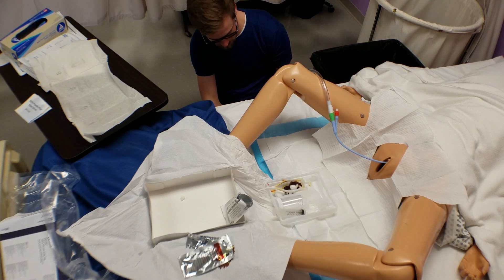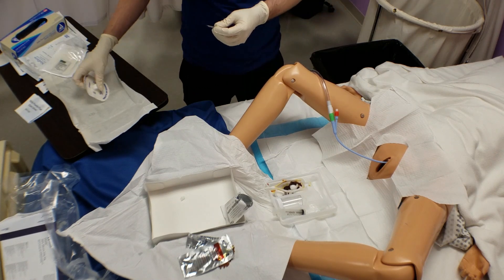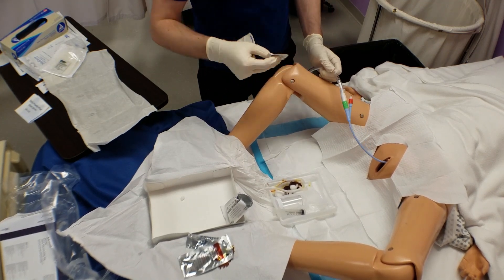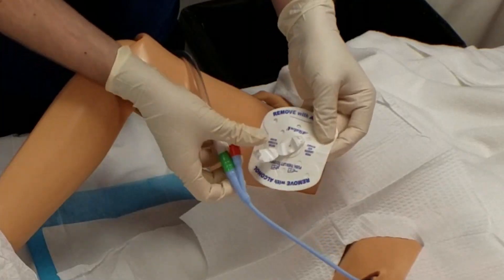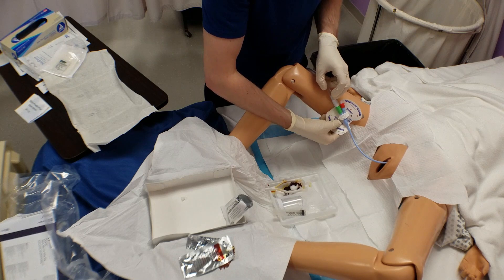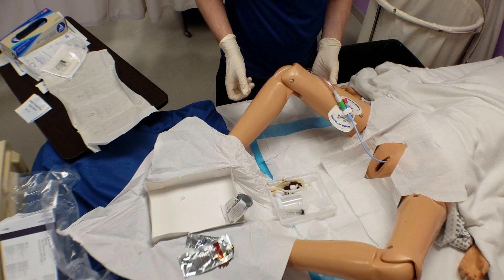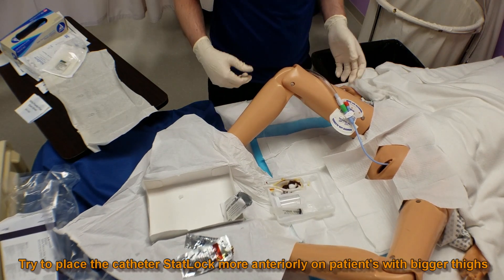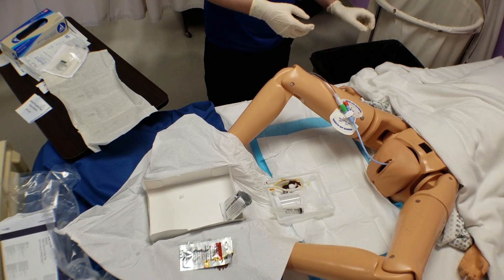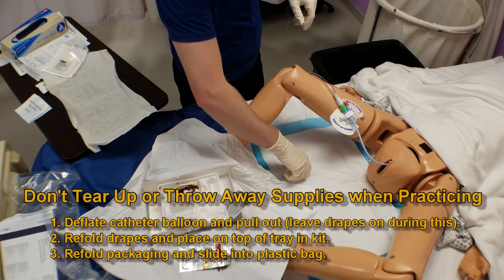The beds in the skills lab only have a hook at the center of the bed side — you may use these for test-off and practice, but do not use them in real situations. Secure the catheter to the patient's thigh using a stat lock or strap securement device. If you use an adhesive-based securement device, ensure that you apply protectant to the skin first. Ensure there is enough slack in the line to prevent constant tension but not so much that the catheter excessively moves in and out of the perineum. Consider the patient's range of motion and thigh size. You will likely need to place the securement device on the patient's inner thighs for the mannequin, but for real patients position it as anteriorly as possible.